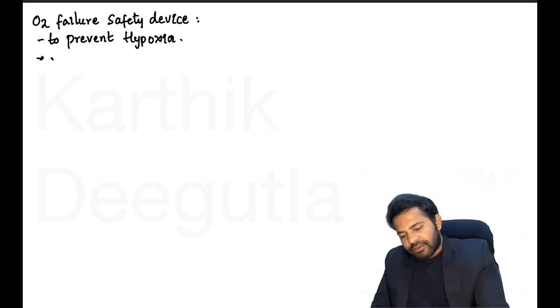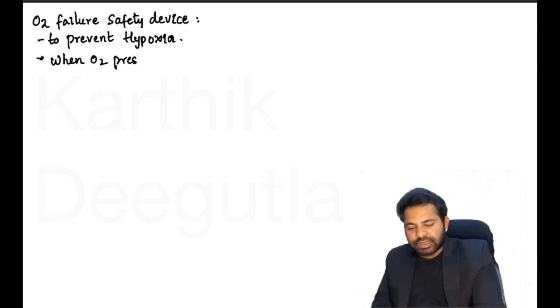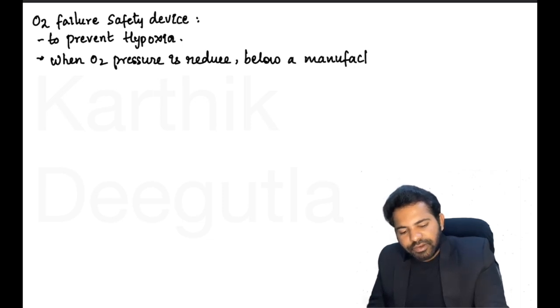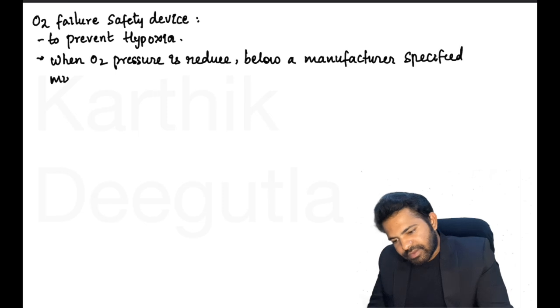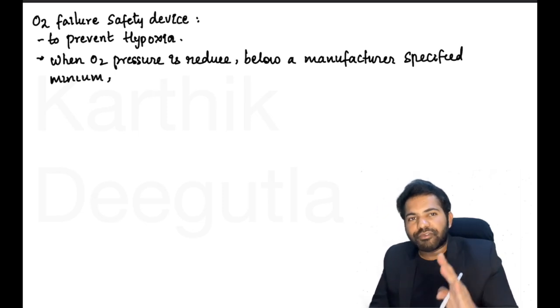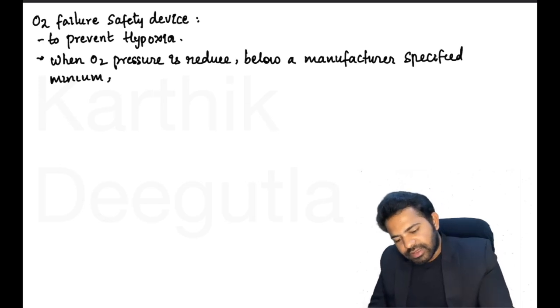Okay, when oxygen pressure is reduced below a manufacturer specified minimum, the delivered oxygen concentration will not fall below 19%.